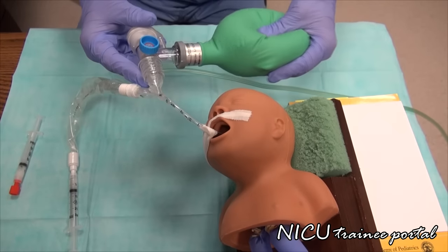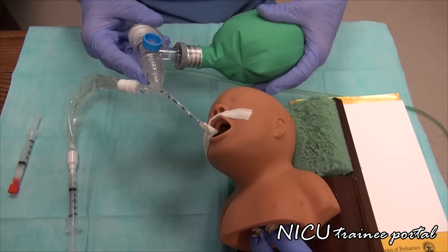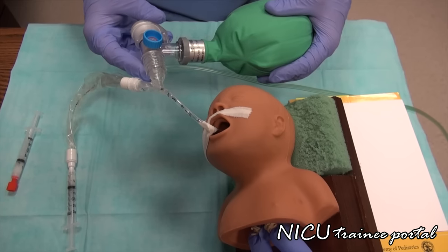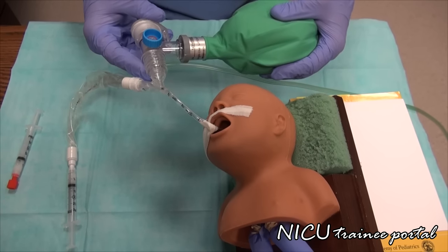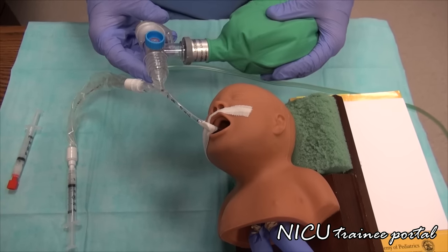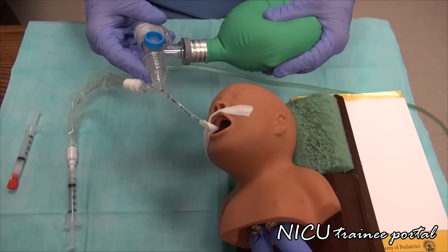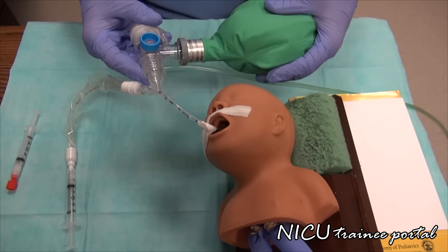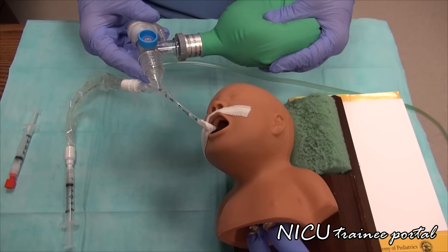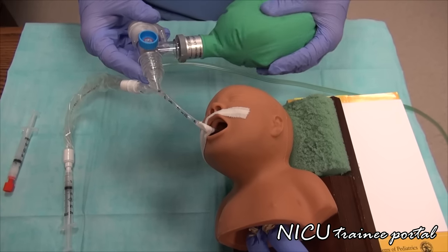During the administration of the surfactant, you might get some of the surfactant coming back up the tube. That's when you want to continue bagging the patient through the procedure, making sure that the surfactant stays going down the tube and not up the tube.